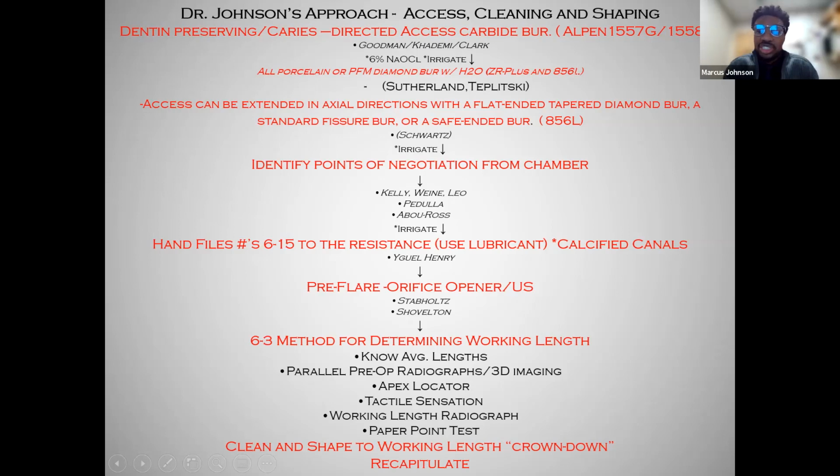Identify points of negotiation from the chamber, okay? And we're gonna talk about that. When we have a concept of what individuals like to say, straight line access, that's just a thought, it's not necessarily a rule. So we're understanding that with new metallurgical advances, we do not have to always achieve straight line access, but we can still properly clean and shape the canals and keep the anatomy in check.